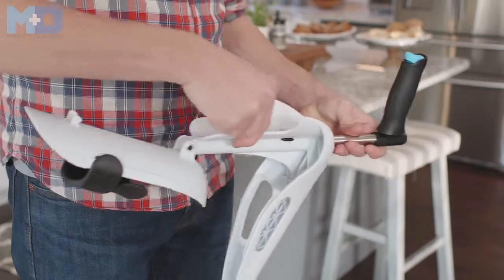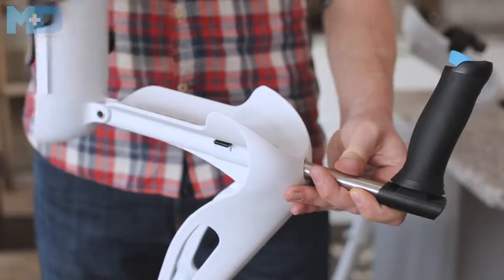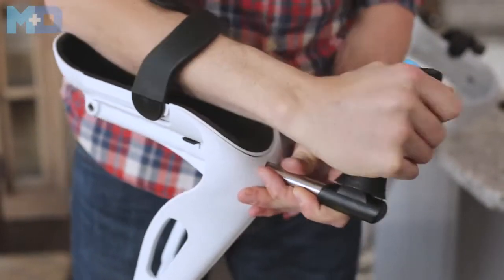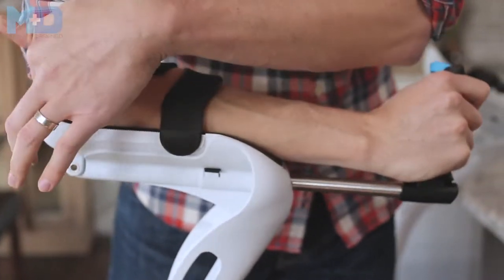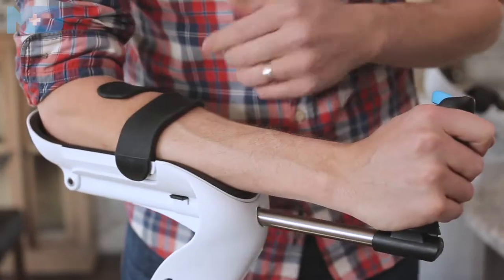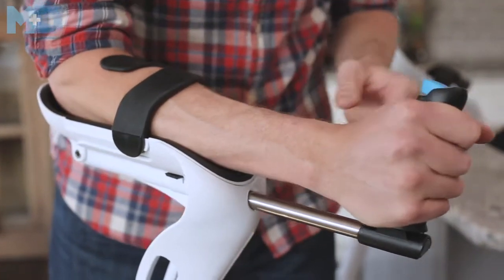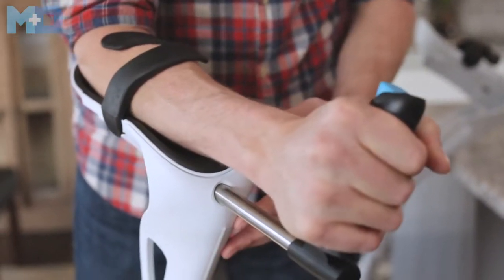To adjust your crutch to your arm length, all you have to do is, with the screw taken out, close the cradle, slide your arm in, and hold onto the handle. Make sure that your elbow is all the way back up against the back of the cradle and that your arm has enough give so that it's not torqued to the side. It's just on a natural angle like this.